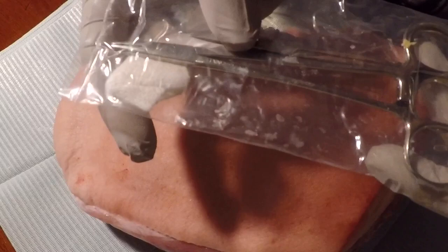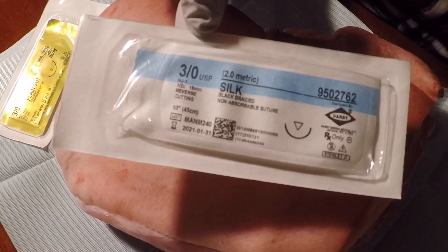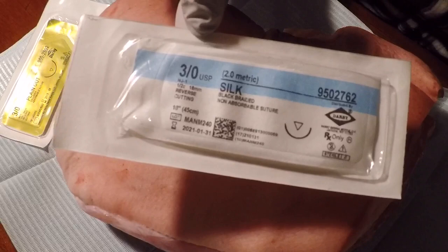For this procedure, you need a suture set, which is a needle holder and a pair of scissors. You're also going to need resorbable sutures — plain gut or chromic gut for the internal or deep sutures — and non-absorbable sutures, such as these silk ones, for the external sutures.